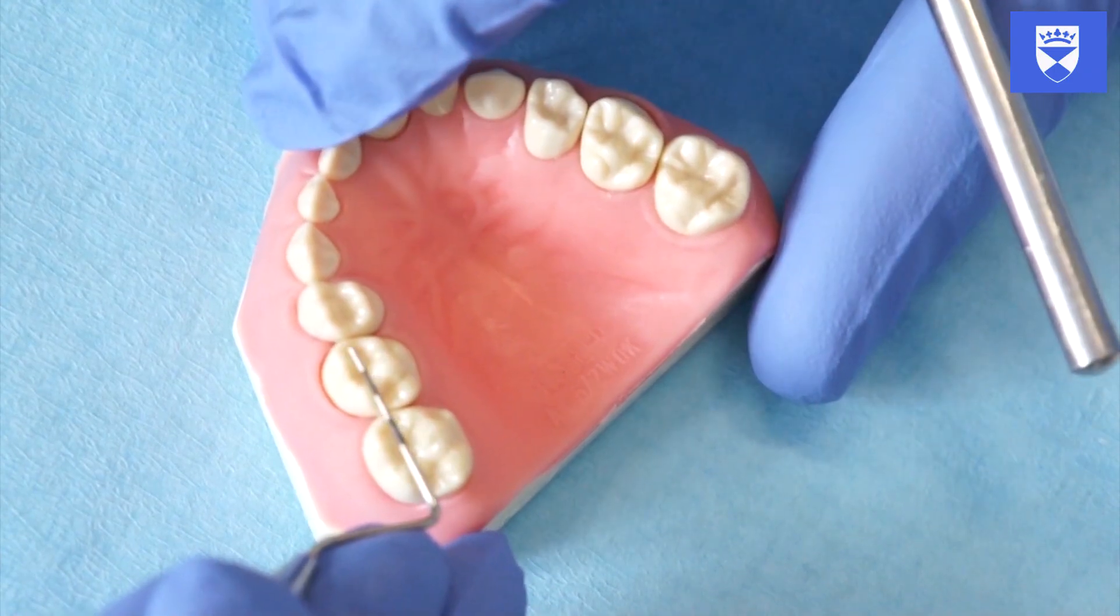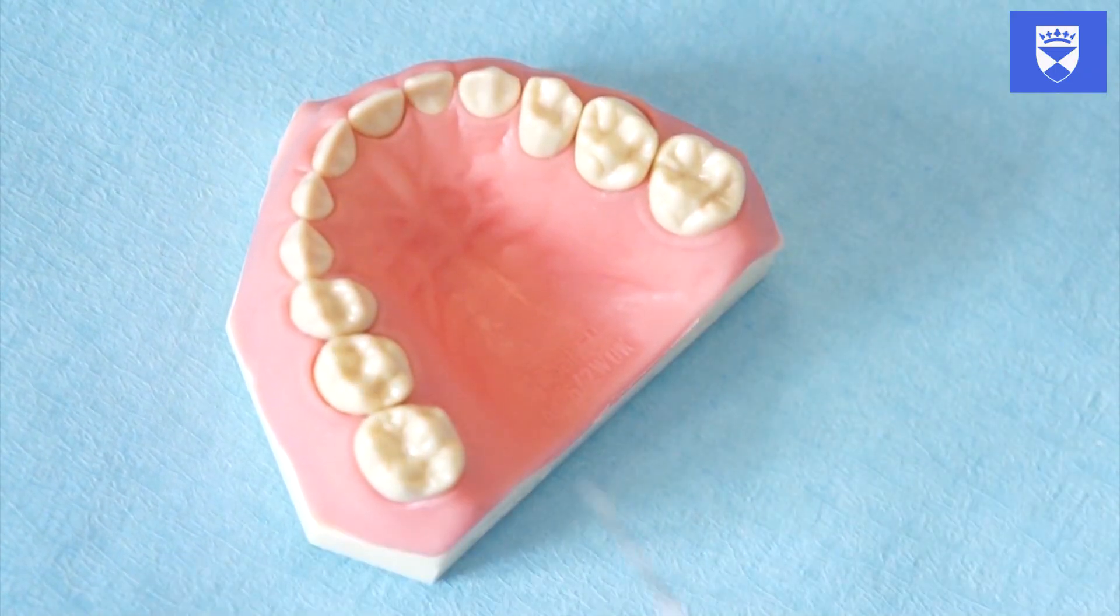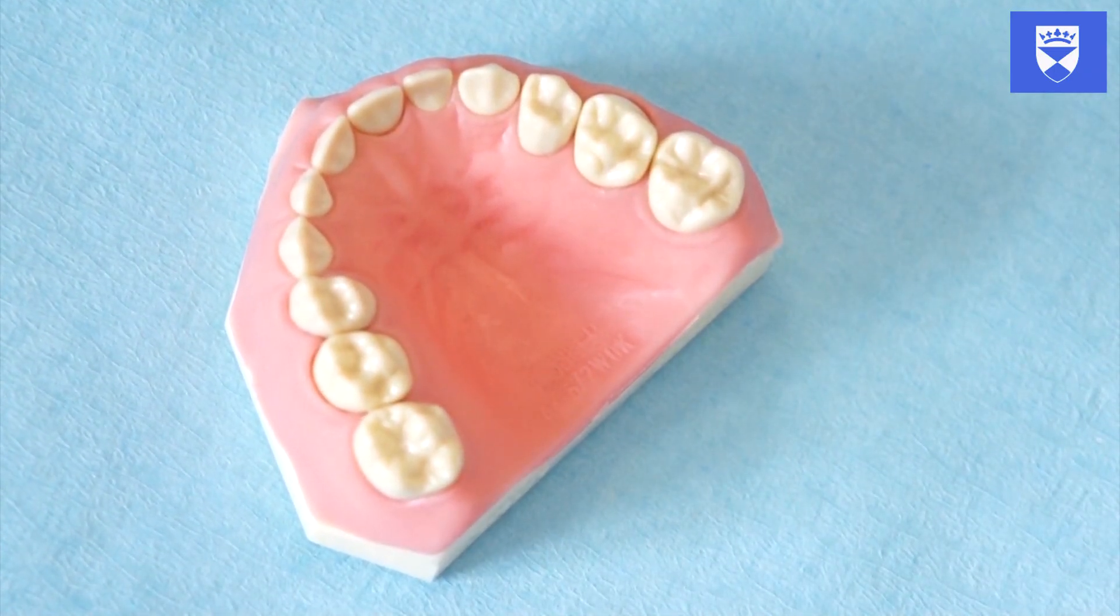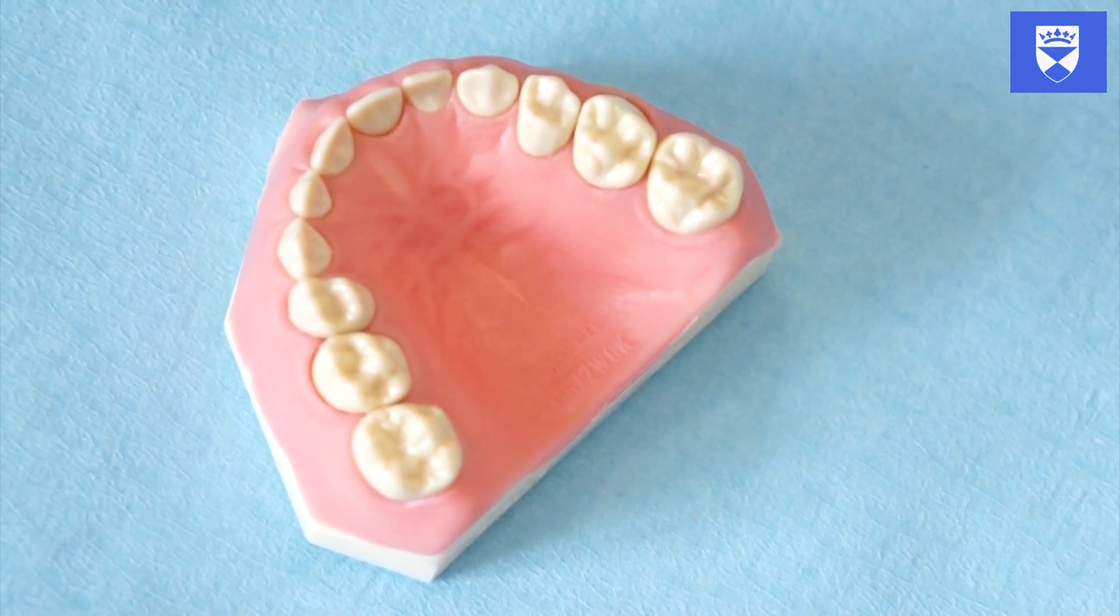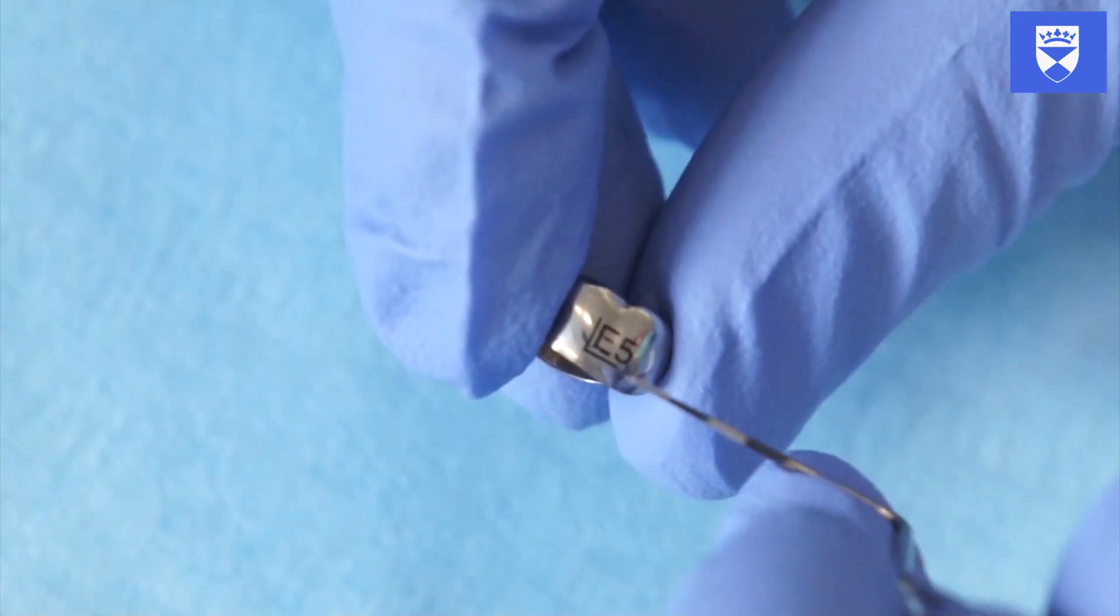Also note any occlusal clearance and measure the distance between adjacent tooth contacts. Use these measurements to aid in the selection of the correct sized preformed metal crown.